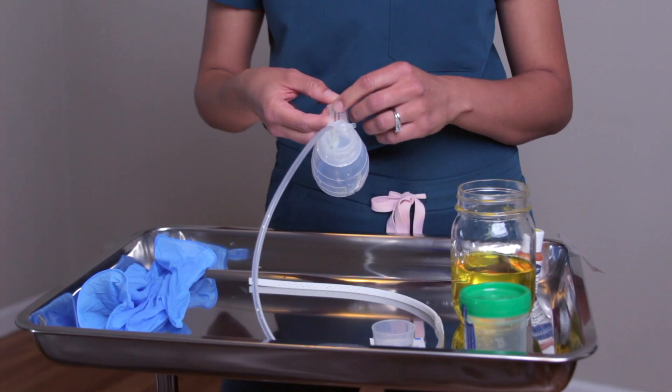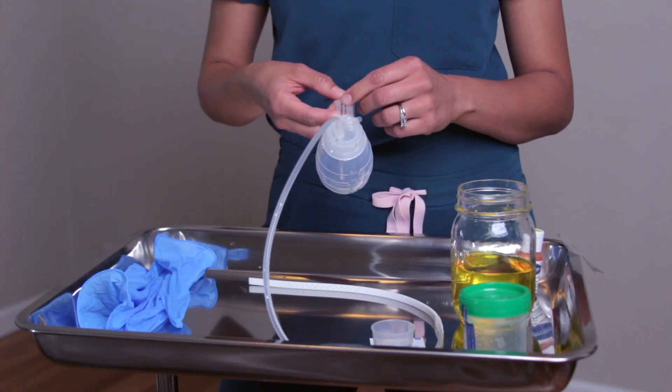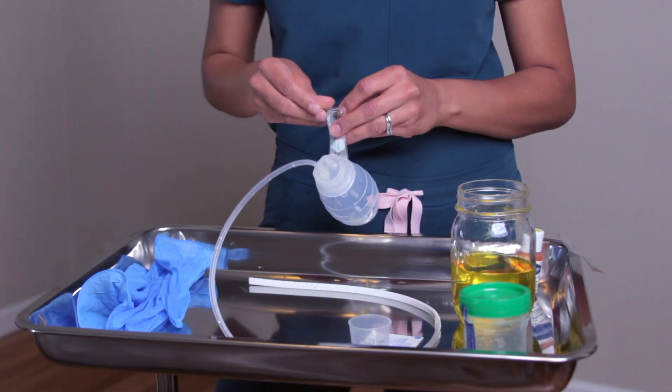You'll also see on this side that sometimes the drain will be labeled with a number if there's more than one JP drain — such as number one, two, three, or four. You'll see this in the setting of a mastectomy where they may have four JP drains, one and two on each side. It will reflect on your flow sheet so you can document the appropriate drainage amount, which the doctors will want to know.